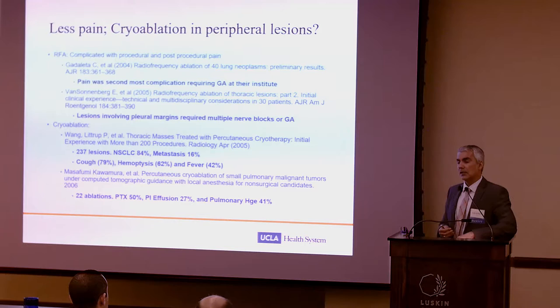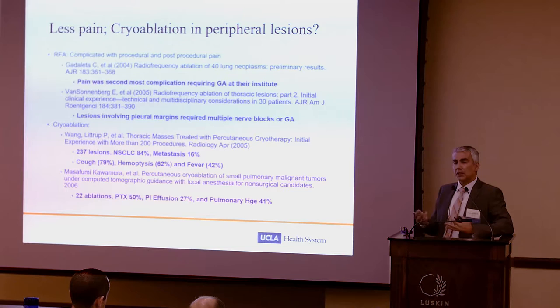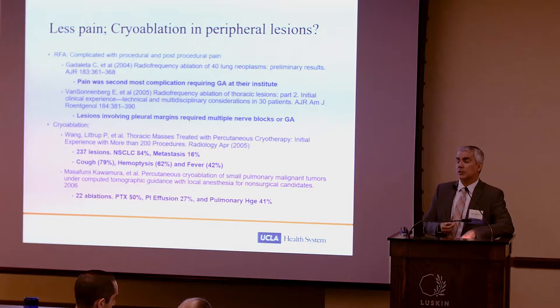We knew exactly where we were going, and we could use multiple probes. So the less pain part came right from the beginning. When you look at the data from RFA, they're very painful. RFA is radio frequency ablation. Same technique, you put a needle, but instead of causing cold, you generate electricity, and that can cause burning and cell death. But these are very painful. Patients had to undergo general anesthesia to even get these procedures done in the periphery of the lung, of course. With cryo, that wasn't the case. Pain wasn't an issue. Of course, bleeding is an issue, and that's something we have to deal with as we're doing the procedure. Because you create an ice ball, and as the ice ball melts with all the cancer cells and all the small vessels which were frozen, they start bleeding, and we have to deal with the hemorrhage part of it.